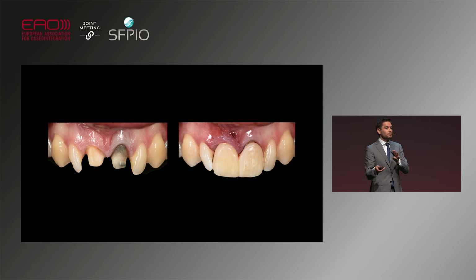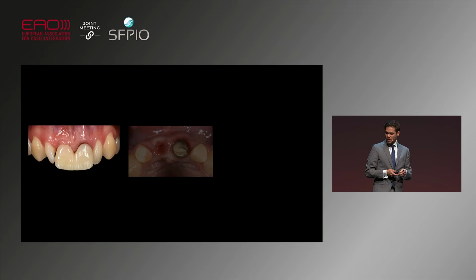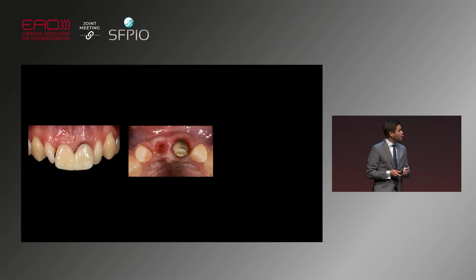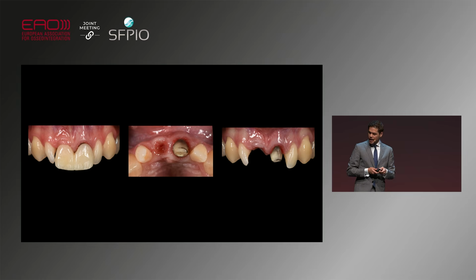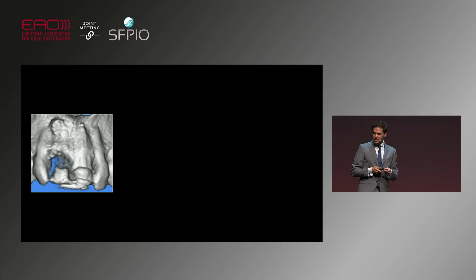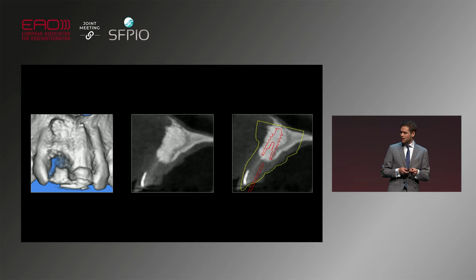We're taking the concepts of immediate implant placement and taking them to ridge preservation to try to simplify the treatments for our patients. So this is the 3-month evaluation. I perform a BOPT preparation on the adjacent central incisor. And then at this point, I can take a CBCT, and the situation has changed dramatically. With a very simple procedure, I can now place an implant relatively comfortably, with no extensive bone augmentation procedure.